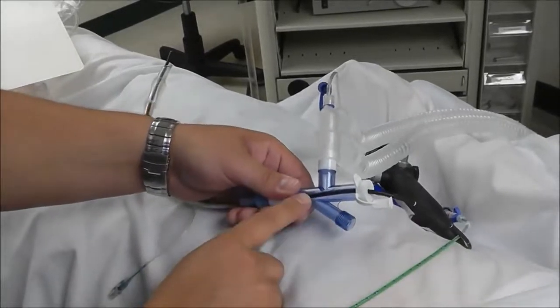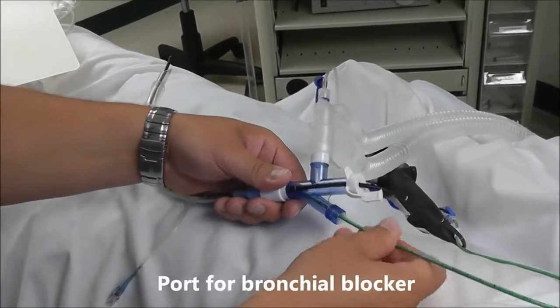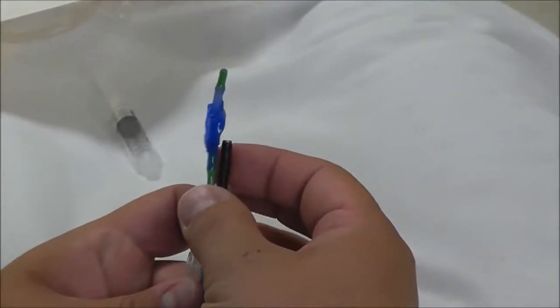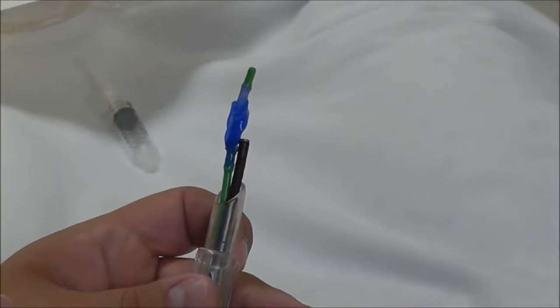And this other port over here on the side allows for placement of your bronchial blocker. Once the bronchial blocker is advanced past the level of the scope, you can visualize seeing the twisting motion which directs the bronchial blocker into either bronchus.